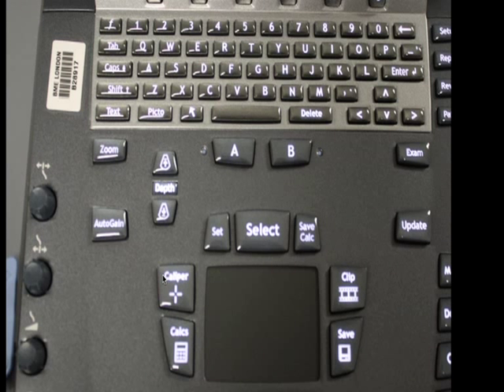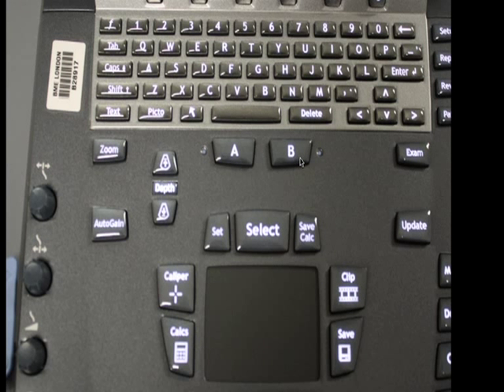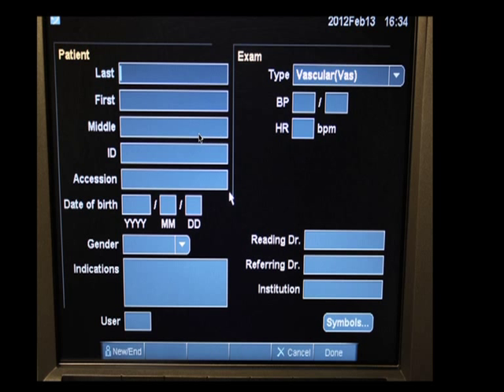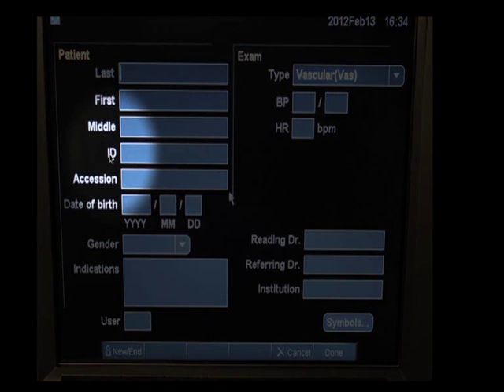We've made it as easy as possible. On the dashboard, there's an A and a B button. Both create the same function: to open or close a patient encounter. To open a patient encounter, press either the A or the B button. This will bring up a screen of patient demographic information which, at first glance, looks a bit overwhelming. The good news is you don't have much to do — you just have to put in a patient's PIN number in the ID field.